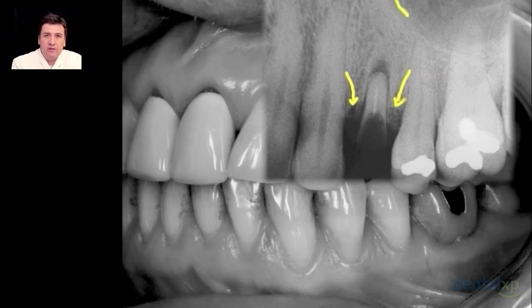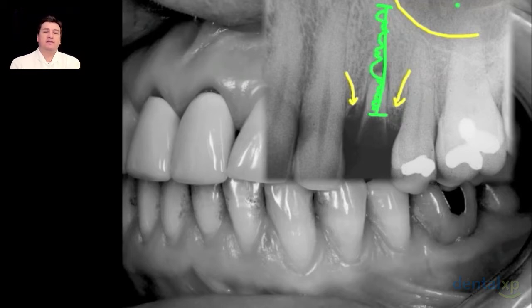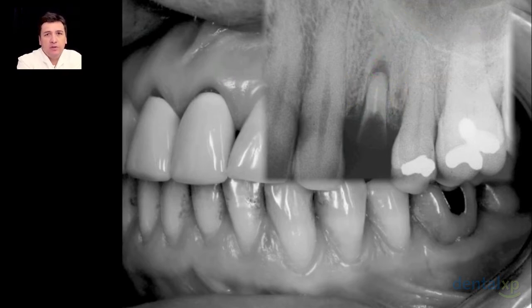What is important to keep in mind is the sinus extension and, of course, the bone at the marginal level in the mesial and distal aspects. That would let us understand how much bone we have to install our implant. In this case, with the correct selection of our implant, we will have more or less 15 or 16 millimeters to install a good diameter implant. For this case, a 3.8 implant.